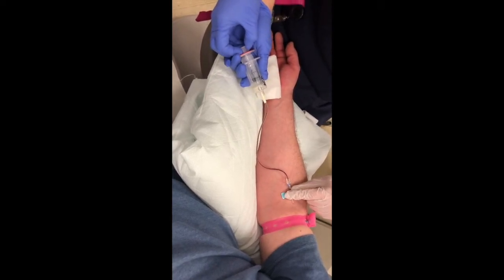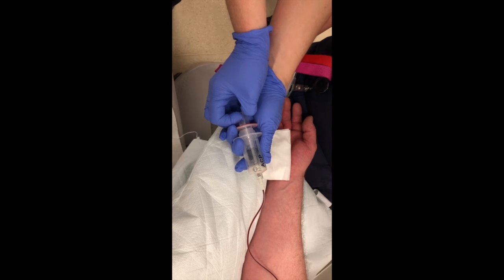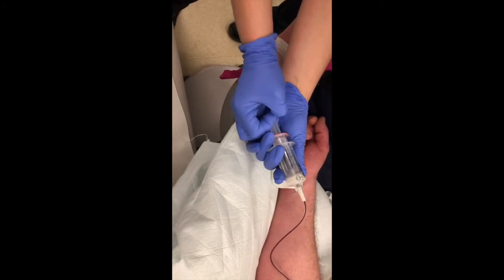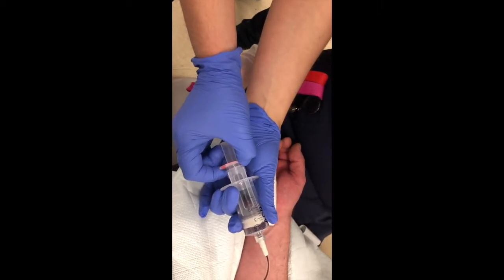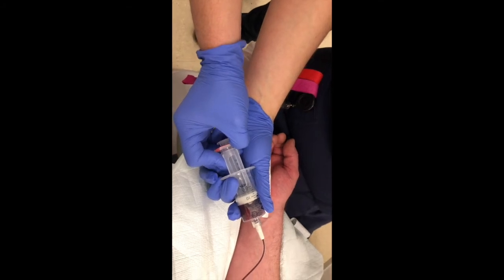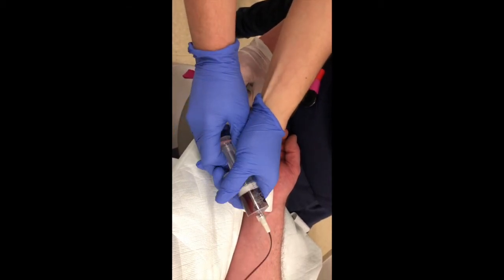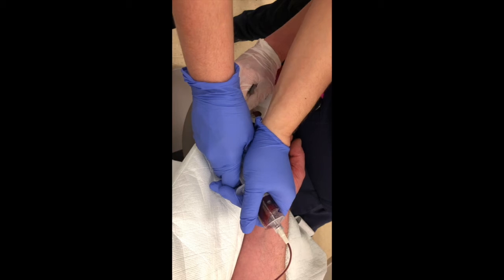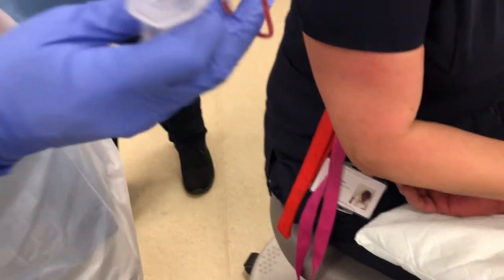It's important that you draw on the correct part of the syringe. Initially we are pulling on the centermost plunger, which is not the right one. You need to pull on the second plunger, and as soon as you do that the blood starts to come in. For this patient's distal biceps I require about 3 ml of PRP, so anything more than 10 ml of blood should be sufficient. Here we have taken about 12 milliliters.